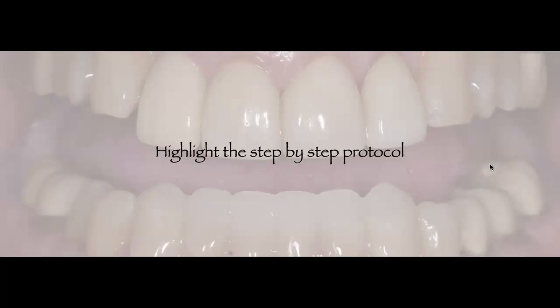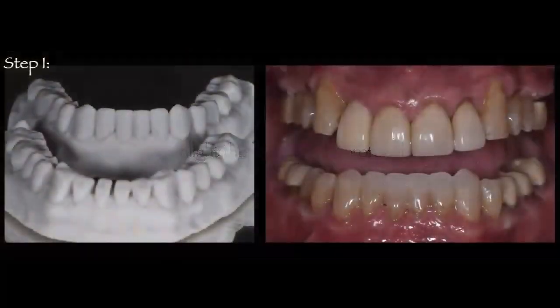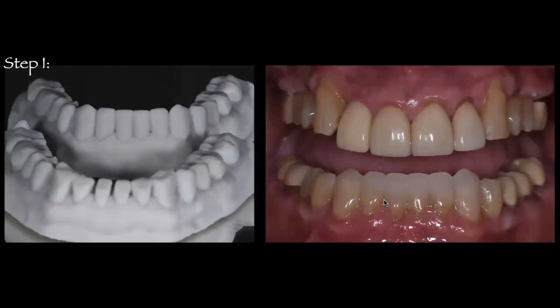What does this look like from a clinical standpoint now directly in our patient's mouth? You can see that using that clear PVS, I have literally taken this wax up and, using a highly filled flowable composite, for this case I used Brilliant Everglow Flow. I injected that Brilliant Everglow Flow into the clear PVS after acid etching and adhesive application on all those mandibular incisors and canines, and then seated that clear PVS, and this is what I got.